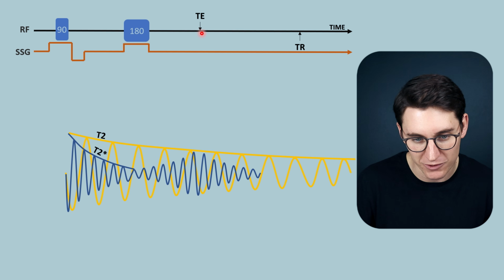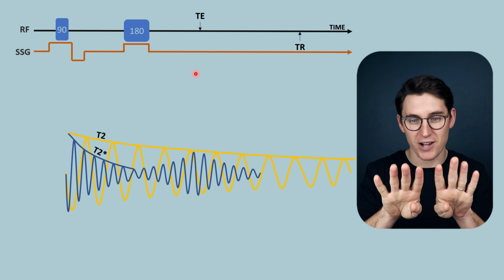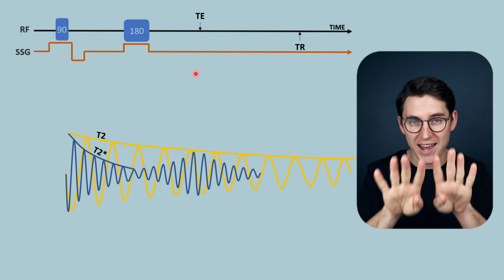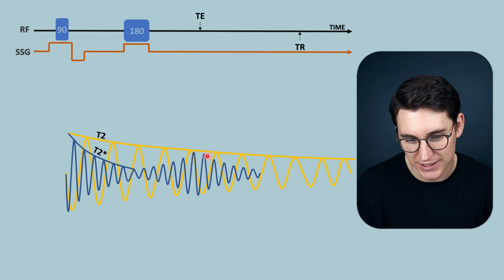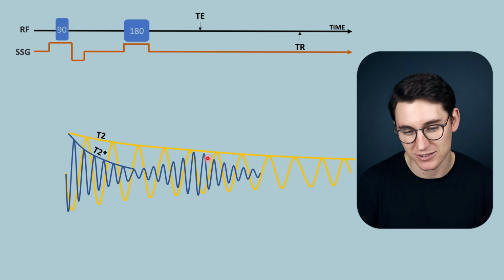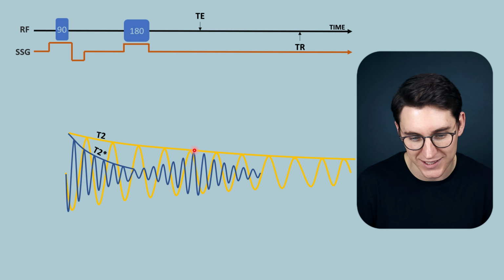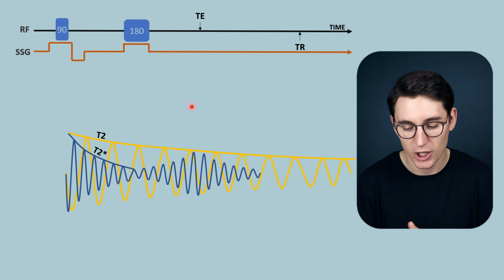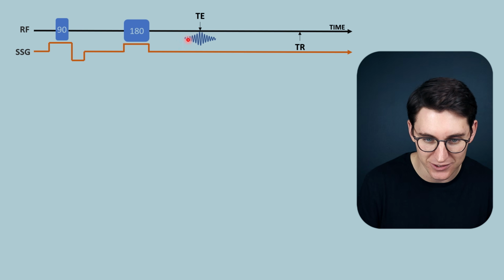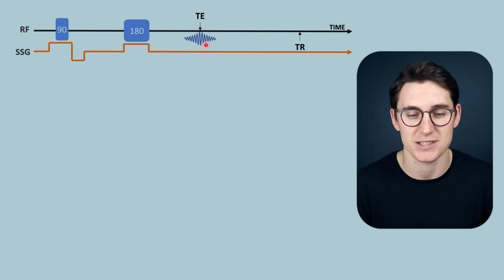So when we are sampling, remember, we're not sampling at one point in TE, we're sampling at multiple points surrounding TE. TE is the time period at the middle of those sampling points. We are going to get signal that increases slightly and decreases slightly. Now, for this talk, this change in signal doesn't make much difference, but when we look at K-space later on, we want to remember that this signal intensity changes over time surrounding that TE. So what I'm going to do is show that signal here on our pulse sequence so that we can remember that this is where we're measuring the signal.